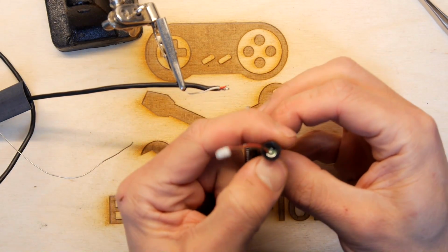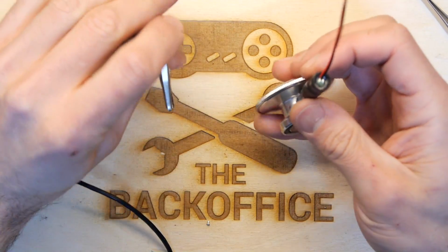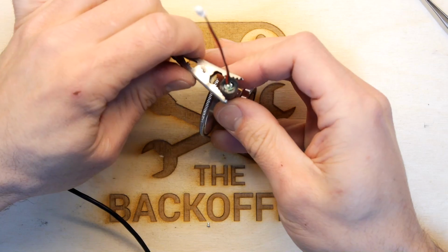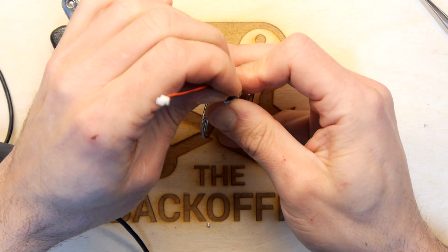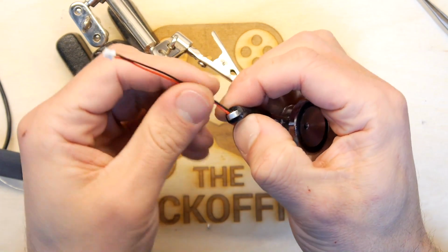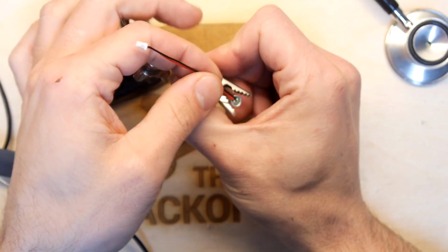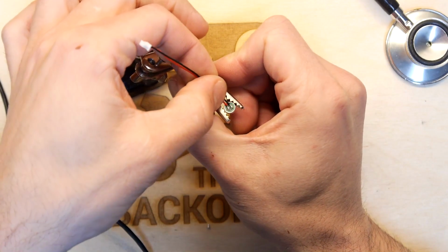And I'm going to look at this. I might try. Silicone technically is heat resistant, so this should be okay to do. But if not, you know, just do the microphone separately. In fact, I'm going to see if I can just squeeze the mic back out. Yeah, it's easy enough to squeeze back out. So I'm going to keep it in these handy jaws.